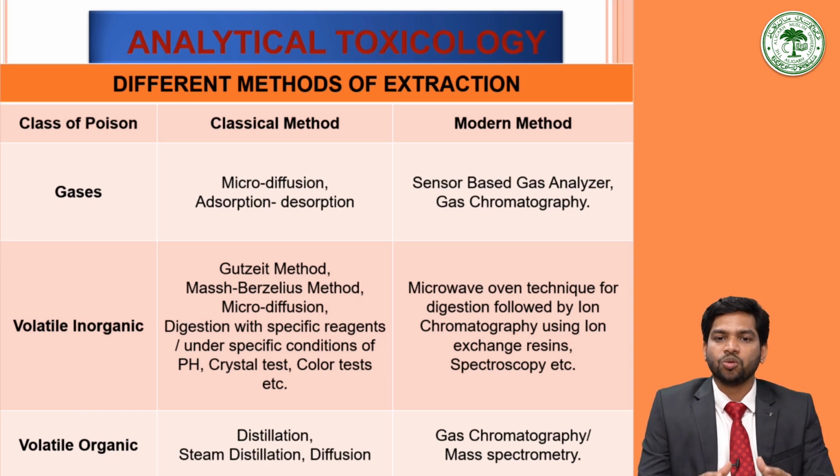Extraction methods are used for removal of such proteins and lipids existing in large amounts in the biological matrices. Also for removal of impurity compounds interfering with the chromatographic separation, for the condensation of the target compound, and for removal of the compounds causing trouble in the instrumental analysis. So for all these purposes, extraction is performed. There are numerous methods of extraction according to the target compounds.